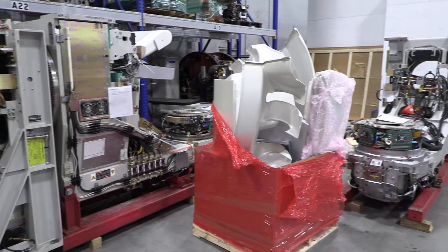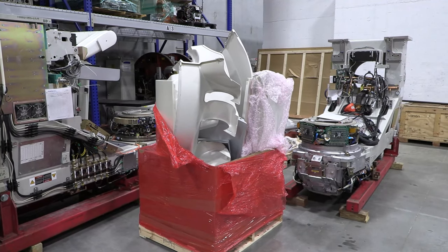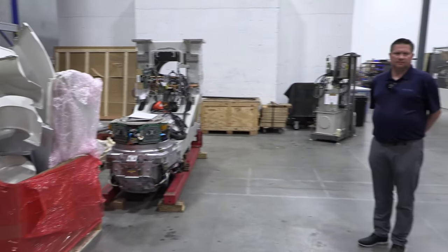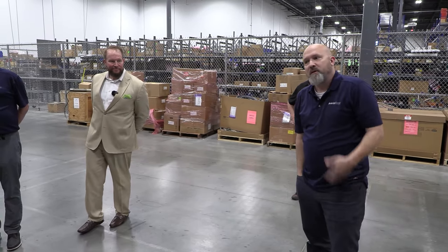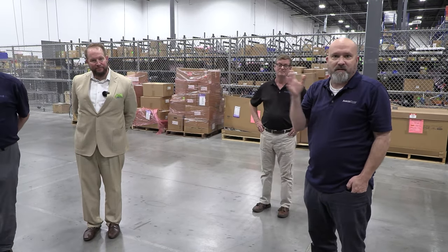Holy cow. With less than a quarter of a millimeter of movement, because everything's based on isocenter, 100 cm. So if you put a needle out at 100 cm and a needle this way, it will have less than a quarter of a millimeter walkout. That's really how precise that 20,000 pound gantry is. That's almost unheard of. Well, when you're radiating people, radiating their brains, you got to make sure you're within a millimeter. Just the mass that you're moving, that precisely. Wow. Making sure that radiation goes where you tell it's going. That's so cool.